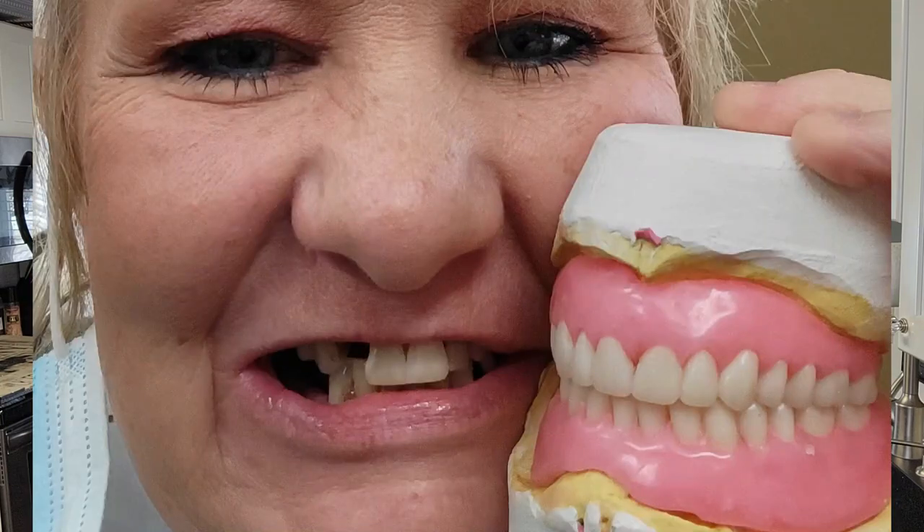I told her, are the teeth big enough? That was all wax — it was so cool. One of my questions was, are these teeth too small? And the dentist said no, they're perfect — a perfect size. My teeth before I had them extracted, my gums were so receded. My teeth looked very, very long to me, which I then understood after I had them pulled out.